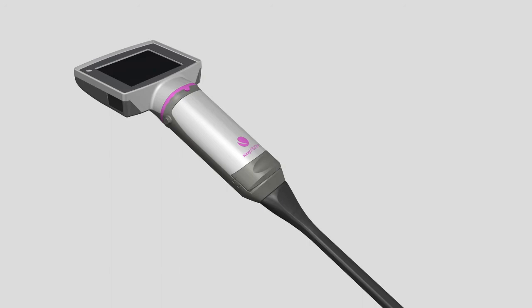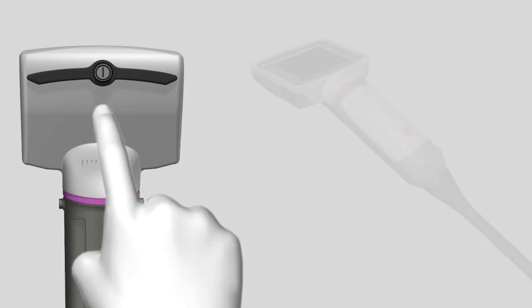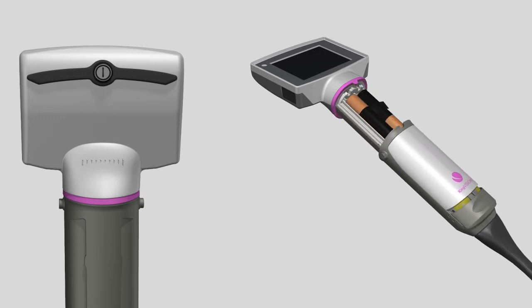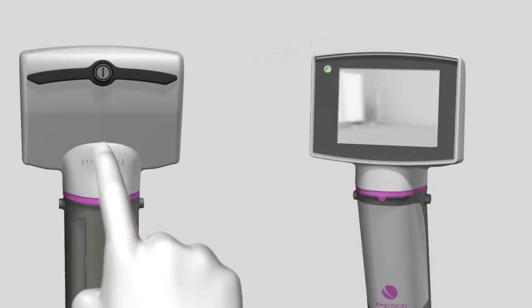If image distortion occurs, simply cycle the display's power by holding the on-off button on the back. If, after turning the display off and then on again, the screen does not show moving images, power off, separate, and then reattach the components, making sure that the adapter and display are securely attached to one another. You can then power the display on again.